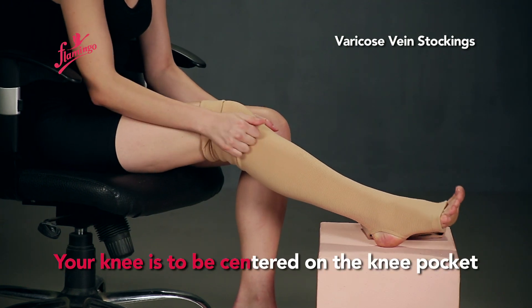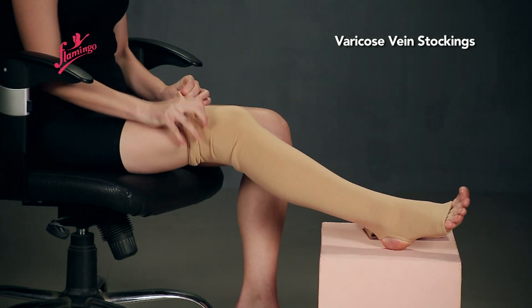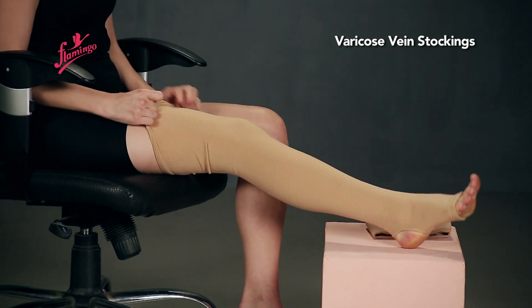Your knee is to be centered on the knee pocket. Remove wrinkles.